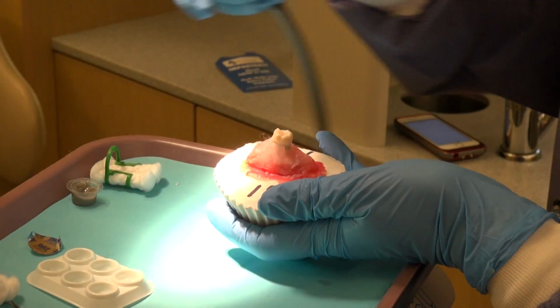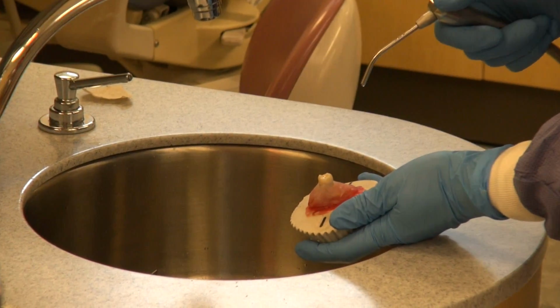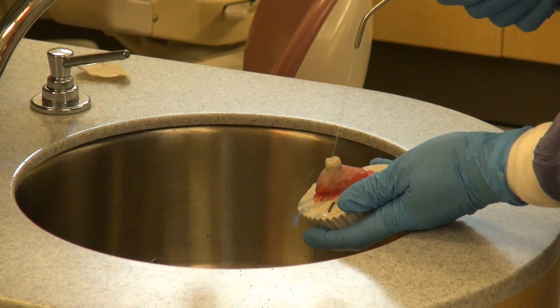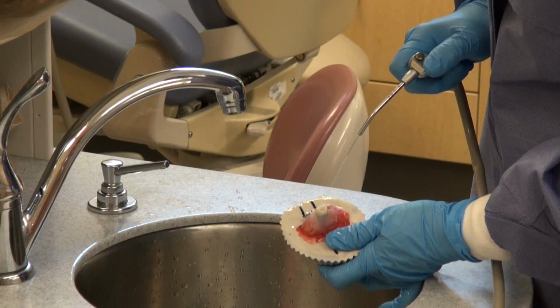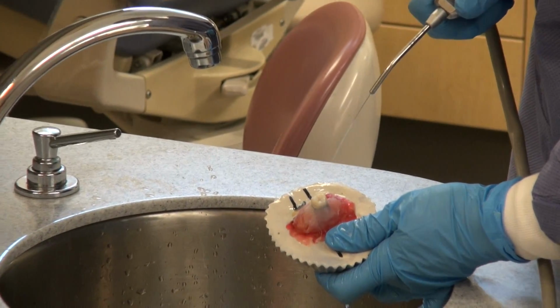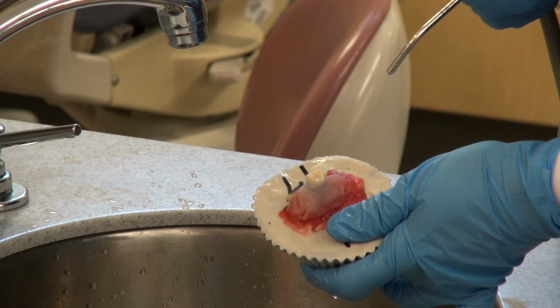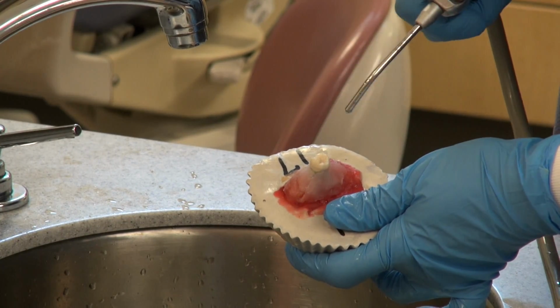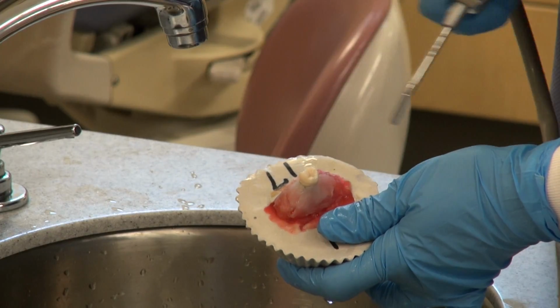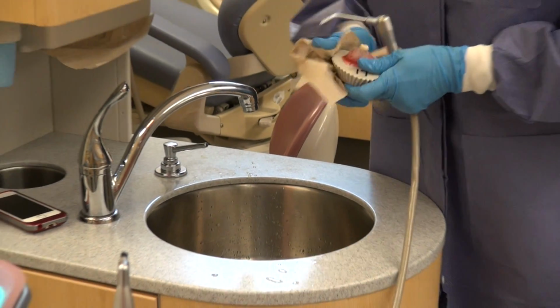We're going to take that cotton roll off, come over to the sink again, and rinse. Water, just water. Okay, we're going to rinse off our acid etch, 30 seconds, and then dry with air. You want to keep your air water syringe tip about 2-3 inches away from the occlusal surface. Dry that for about 30 seconds.